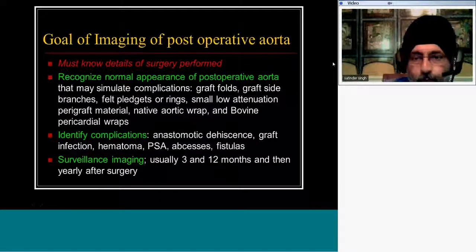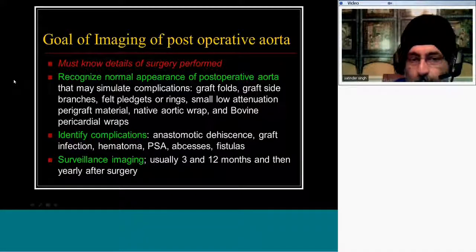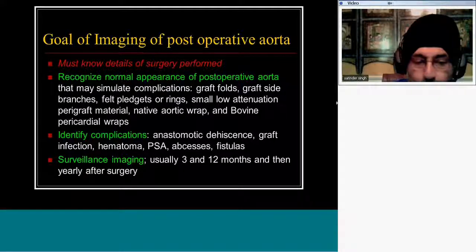So the goal of imaging for the post-operative aorta, first of all, is that you should know the details of the surgical procedure performed to avoid any pitfalls. And also, you should be able to recognize the normal appearance of the post-operative aorta. I think this can very easily mimic pathology, so you should be able to see and say that this is a normal finding and not abnormal. And of course, there are several complications leading to pseudoaneurysm formations or hematomas and fistulas.